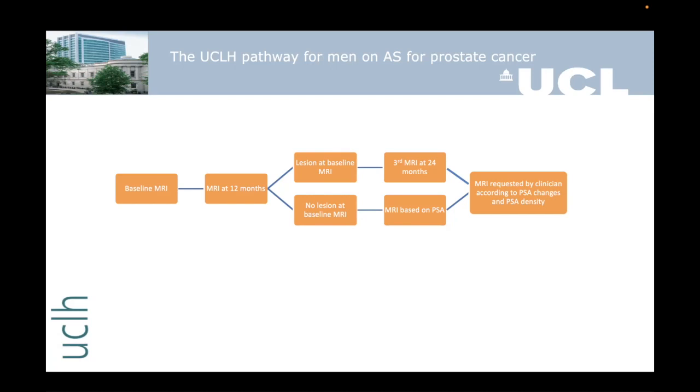I think that's a critical point, Jeremy, because the cohort that we published was just under 700 patients. It was published in European Urology, looking at the longer term outcomes of patients on active surveillance. And one of the key outcomes was that the visibility of the MR lesion does relate to outcomes such as metastasis and survival. So the non-visible 3+4s, which were low volume to be considered for active surveillance, actually behaved pretty much like the 3+3s. And that's an important determinant of why we have a slightly different protocol for whether the lesion was visible or not.